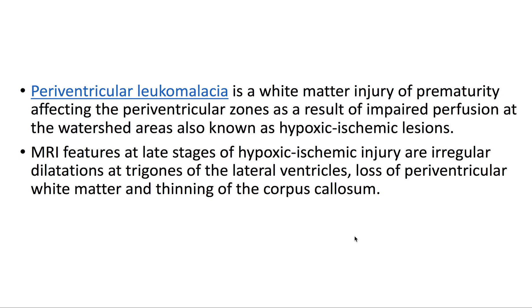Also known as hypoxic ischemic lesions, MRI features at late stages of hypoxic ischemic injury are: irregular dilatations at the trigones of the lateral ventricles, loss of periventricular white matter, and thinning of the corpus callosum.